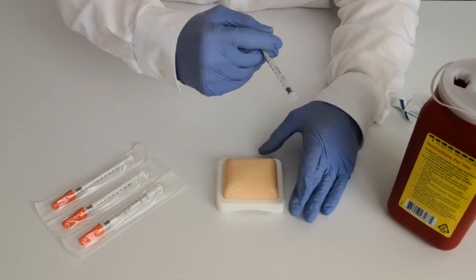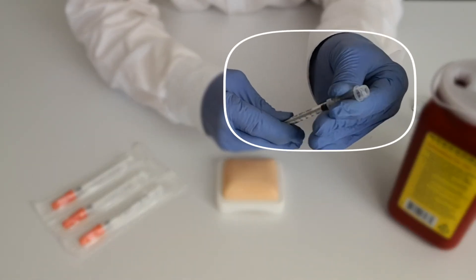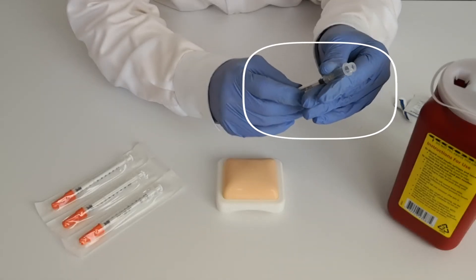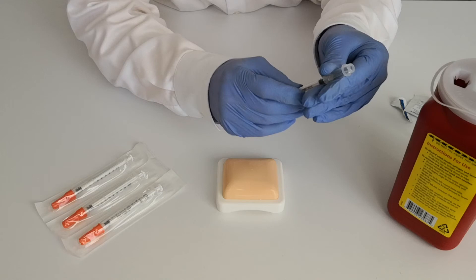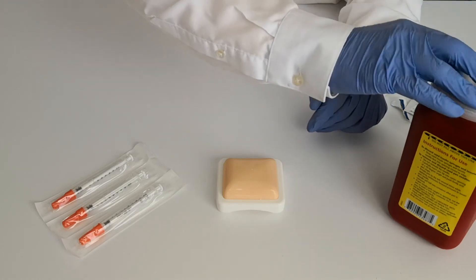When you finish the injection, you need to permanently lock the safety shield. This is done by sliding the safety shield forward over the needle until you hear a click. Then twist the shield in either direction until you hear another click. Now the safety shield is permanently locked and safe. Then discard the syringe into a sharps container.